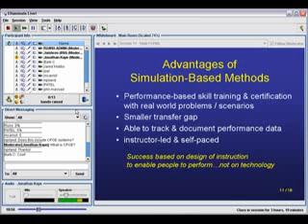The core message, I think, in terms of what makes good simulations, though, is what makes good training. That the success is based on the design of the instruction that enables the people to perform. It's not on the technology. And that took me a while. It took me much longer to realize that than probably I should have. That when people build simulations, the focus tends to be on the simulator.